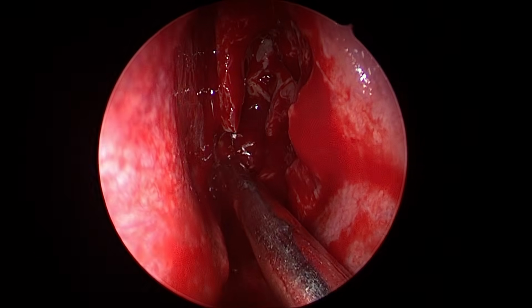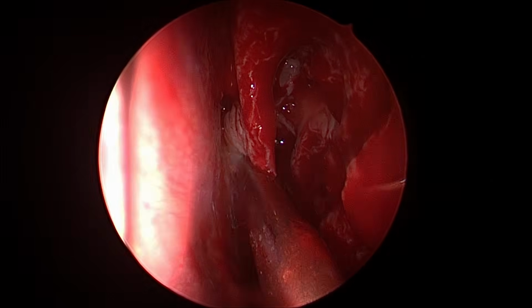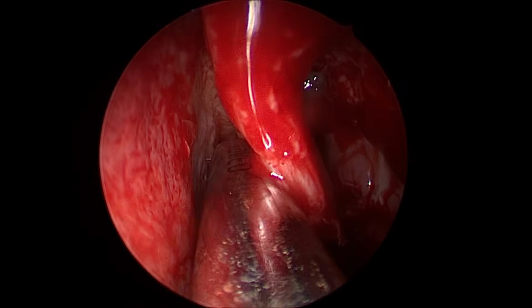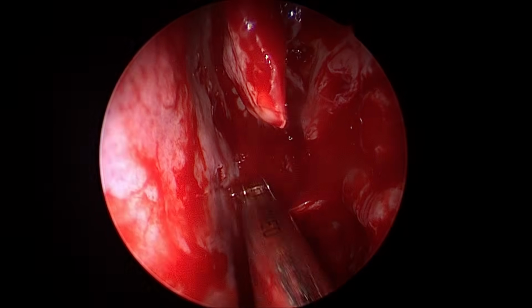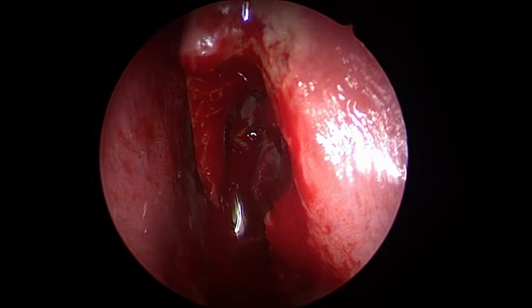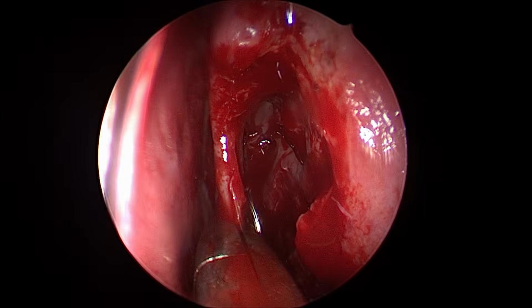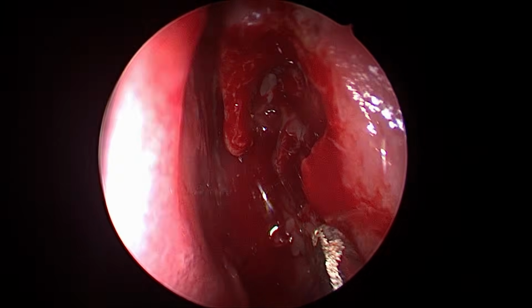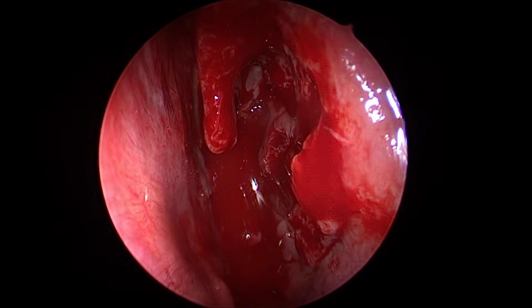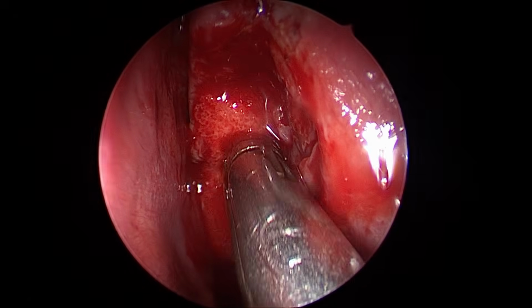See this now? This will never ever come back. See the polyps medial to it. This will not come in my way of irrigation. Can you see the olfactory mucosa above? So, be gentle to it. Be gentle to the olfactory mucosa. Now see my access. Number one, I have just removed the polyps and trimmed the turbinate to improve my access.